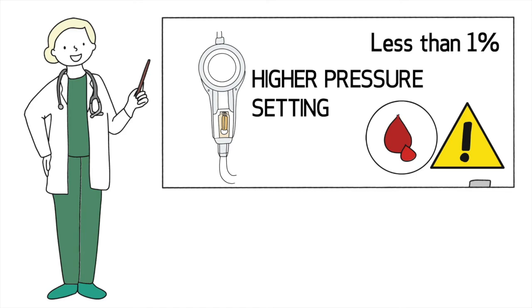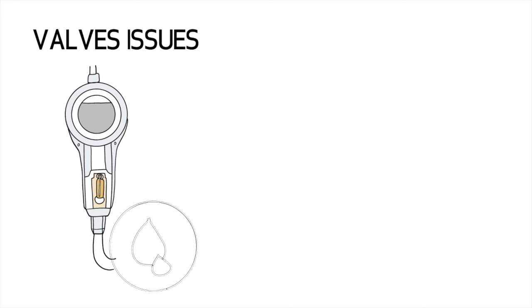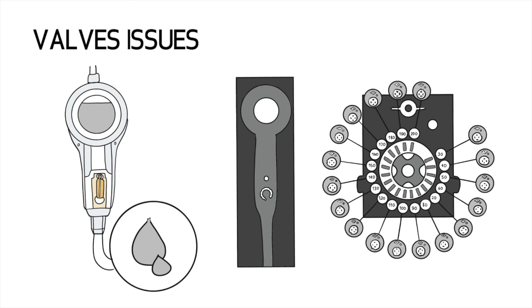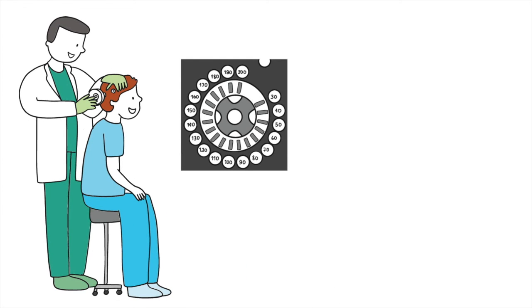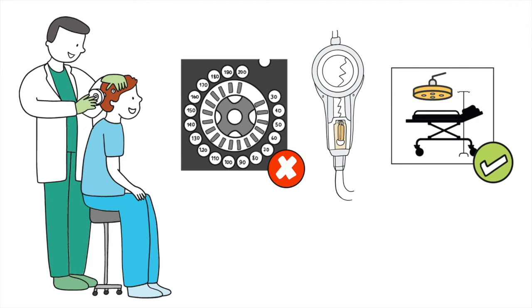Shunts operate by allowing fluid to flow when the pressure is higher than a specified setting. There is always a risk that the setting of the shunt is incorrect. Some shunt valves have multiple pressure settings that can be changed with a magnet over the skin. This can be performed at the bedside or in the office by your neurosurgeon if deemed necessary. If the setting cannot be appropriately changed or the wrong type of valve is implanted, surgery may be required to change your valve to one with different pressure settings.